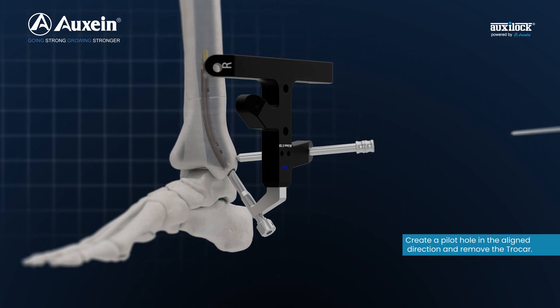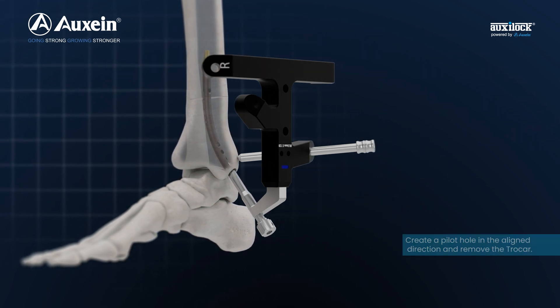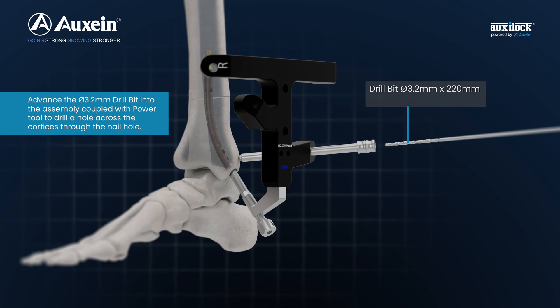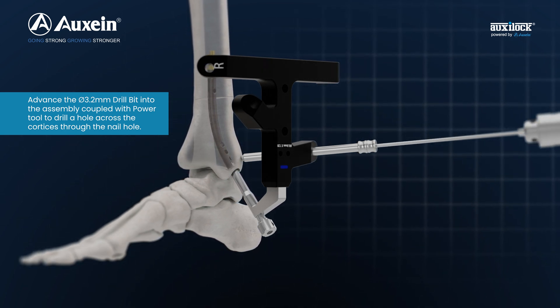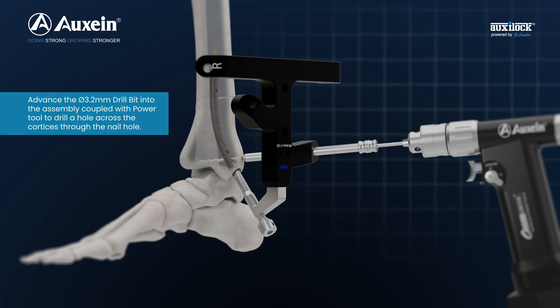Create a pilot hole in the aligned direction and remove the trocar. Advance the 3.2 mm drill bit into the assembly coupled with a power tool to drill a hole across the cortices through the nail hole.